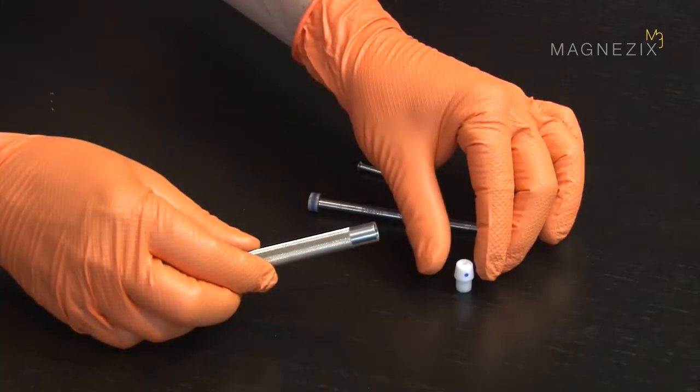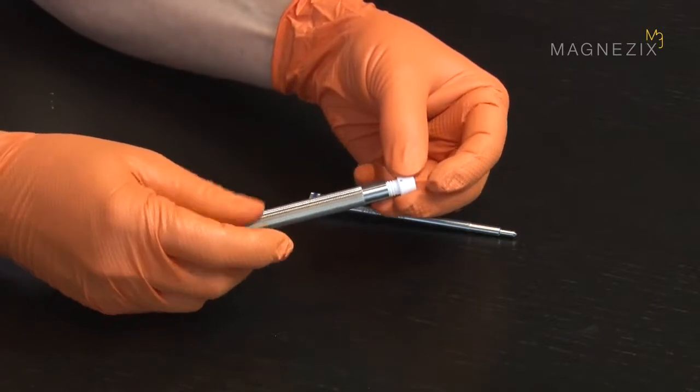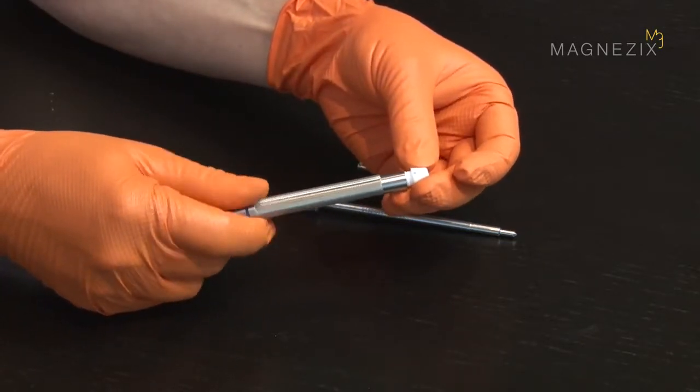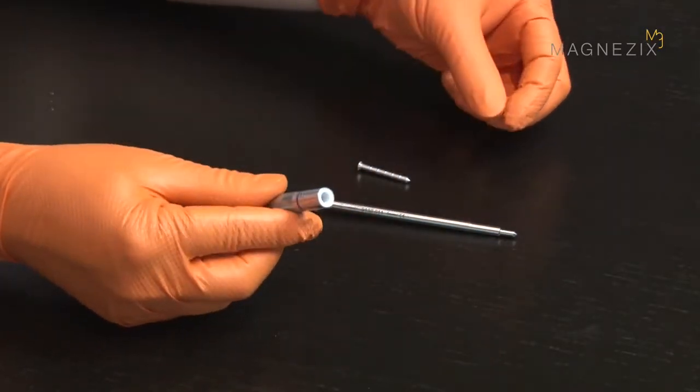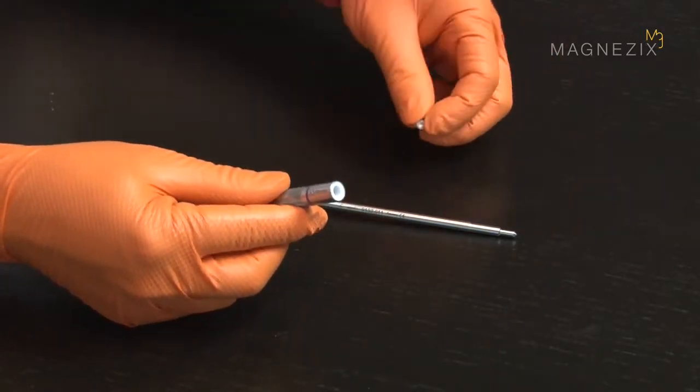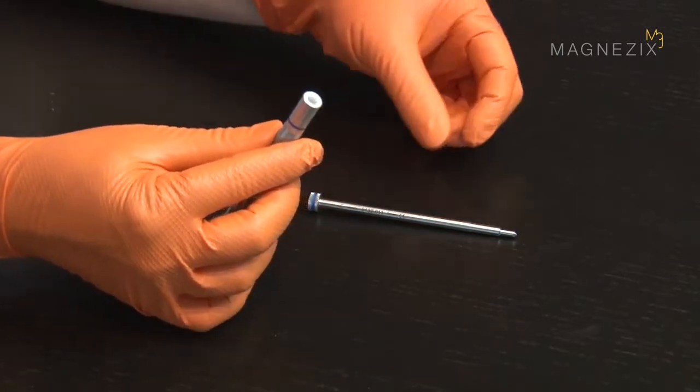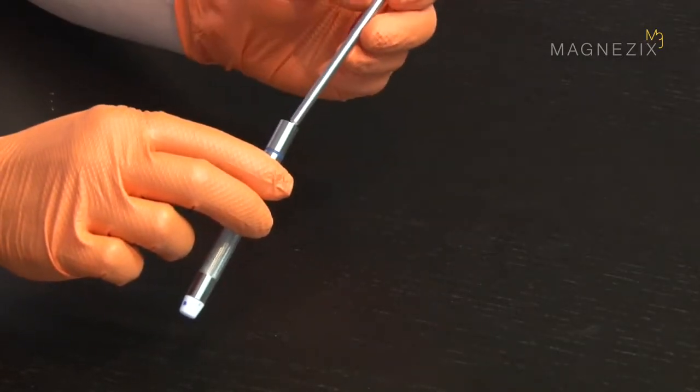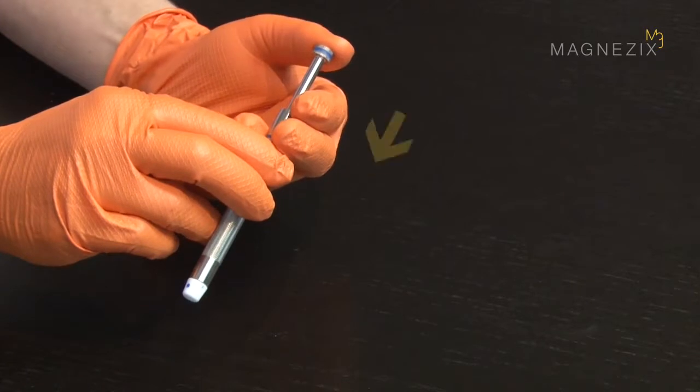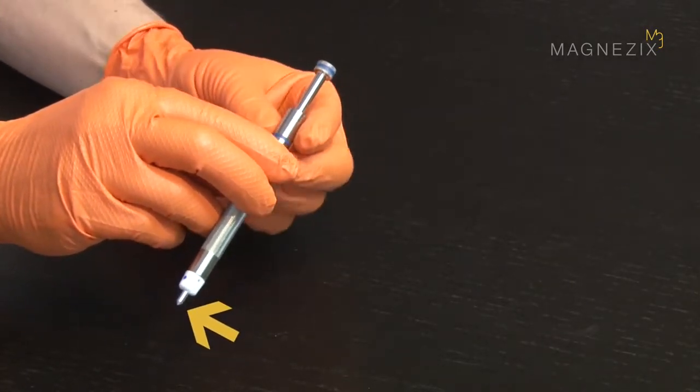To prepare the 3.2 mm impactor, the blue coded impactor tip is screwed into the blue coded impactor sleeve. The impactor sleeve can now be loaded with a 3.2 mm pin. The impactor insert is inserted into the sleeve. Gently press the impactor insert to make the Magnesix pin appear at the impactor tip.